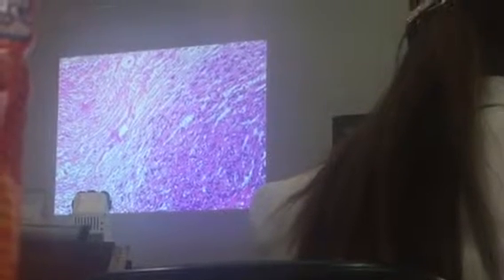Question. Can you see necrosis in leiomyomas? No, you don't. Okay? Oftentimes, what you do see in leiomyomas is called hyalinization. It's not exactly necrosis, no? It's not tumor necrosis, but it's just that it hyalinized, no? It outgrew its blood supply. Okay? So pwedeng you can see something like this, no, but not exactly, no?